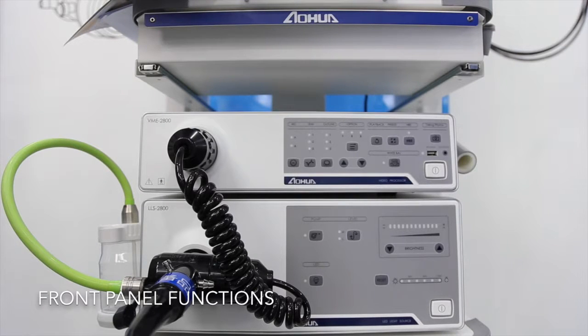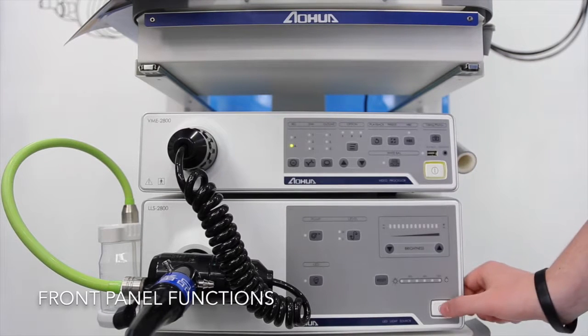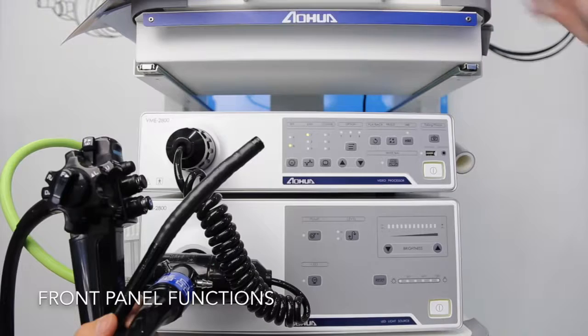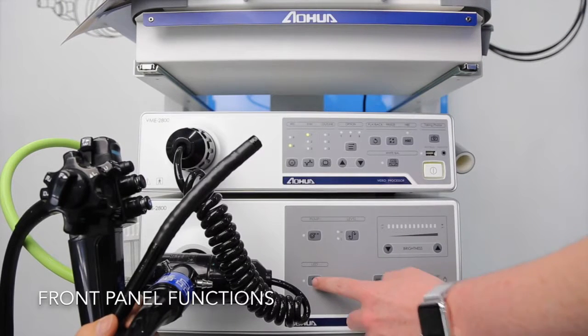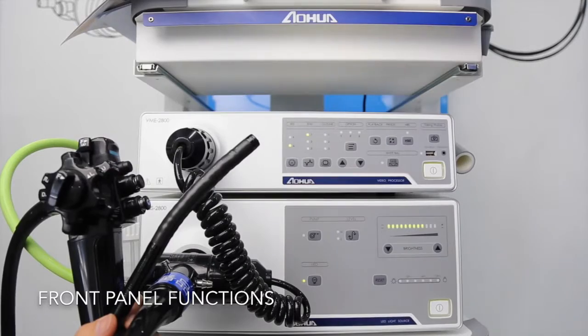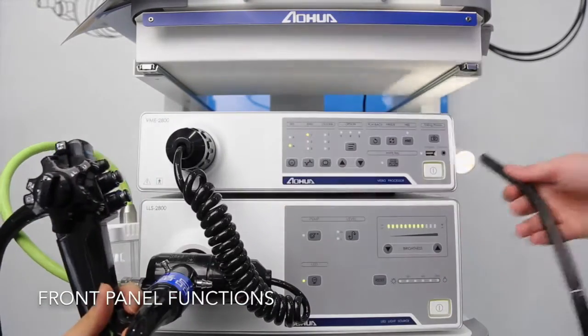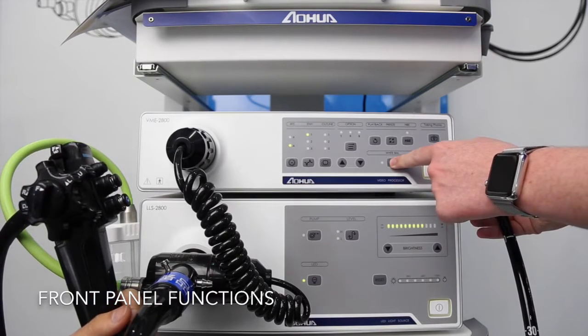I will now take you through some of the functions of the VME-2800. We'll start by turning on the light source and the processor. This button is used to turn on the LED. From there you can put the insertion tube into the white balance cap and press the white balance button.